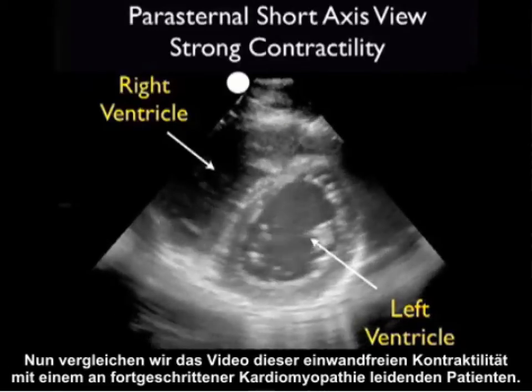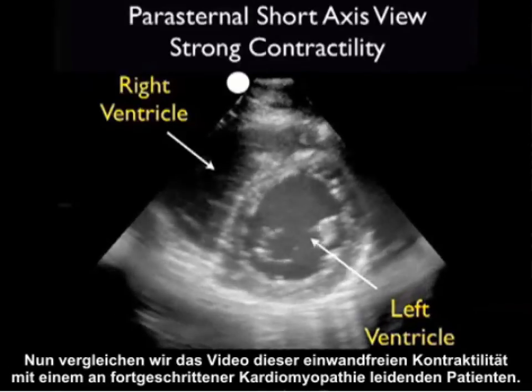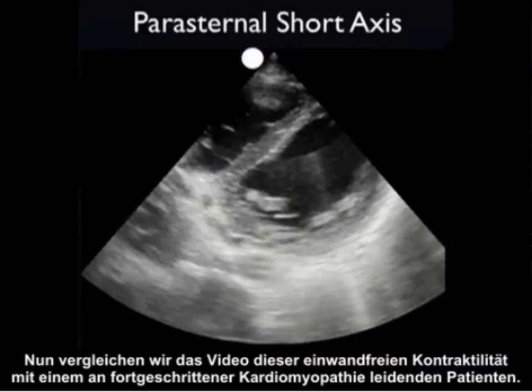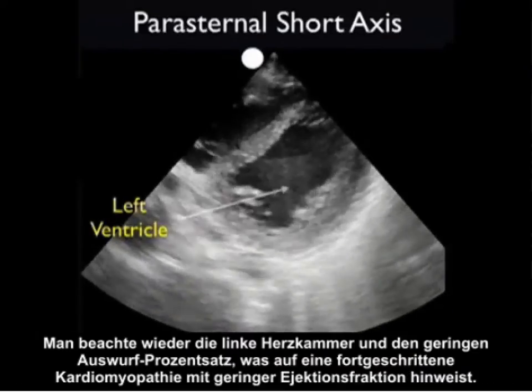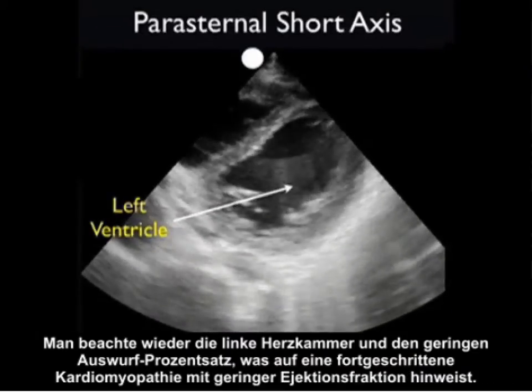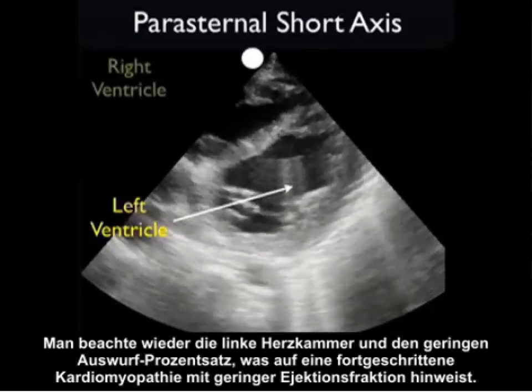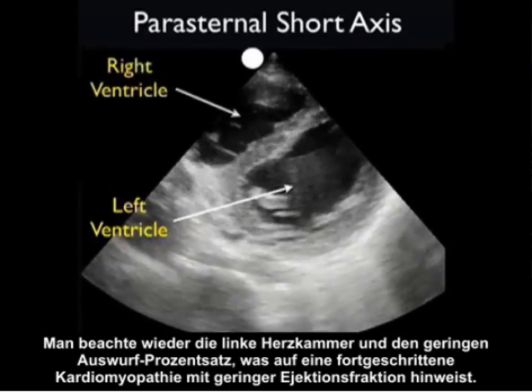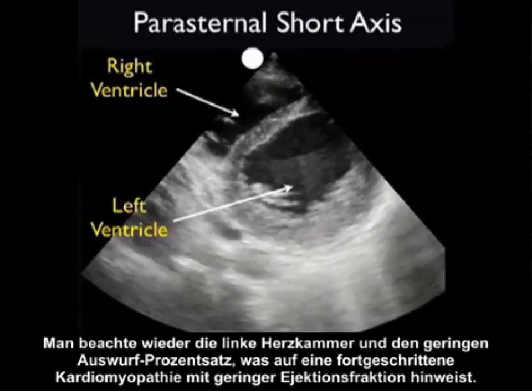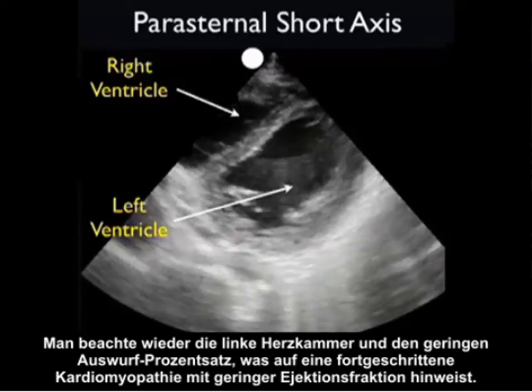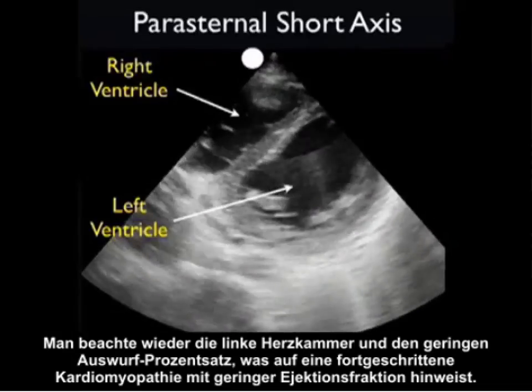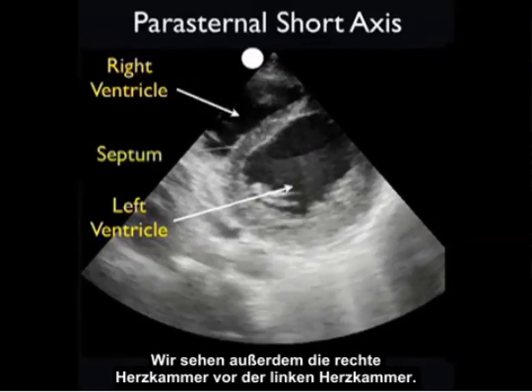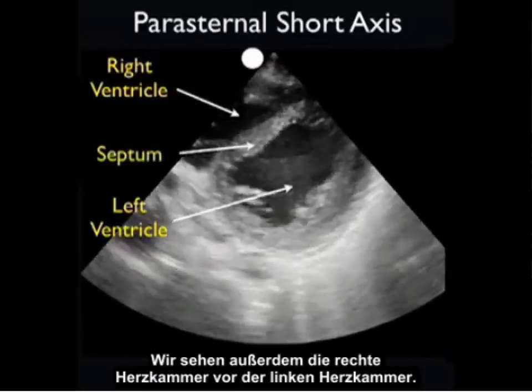Now let's contrast this with another patient who had an advanced cardiomyopathy. Note the left ventricle and the poor percentage change from diastole through systole, indicating an advanced cardiomyopathy with low ejection fraction. We can also see the right ventricle anterior to the left ventricle.